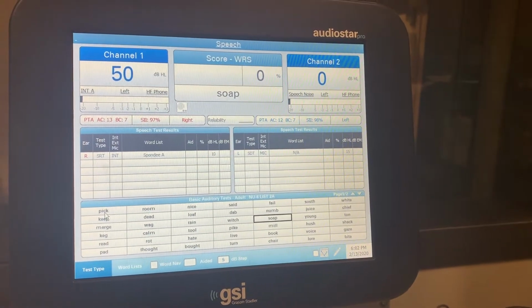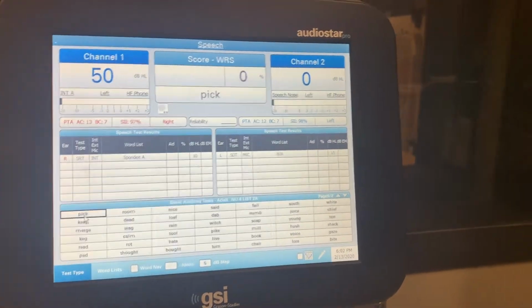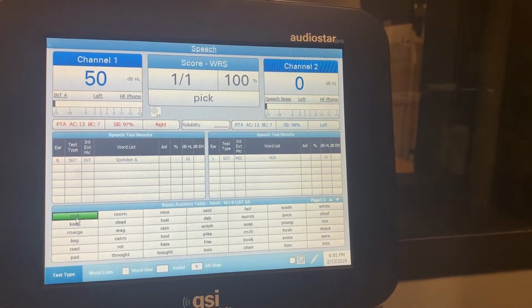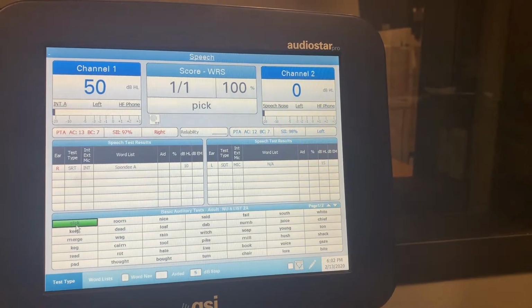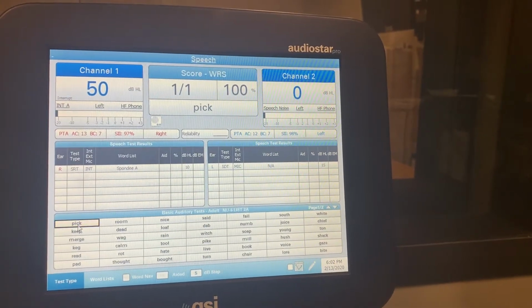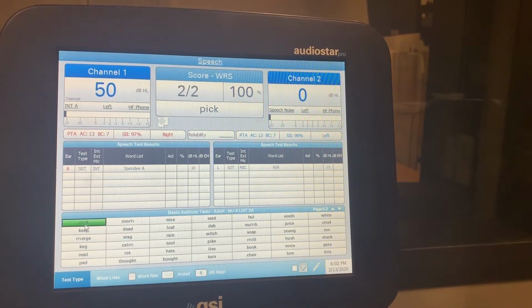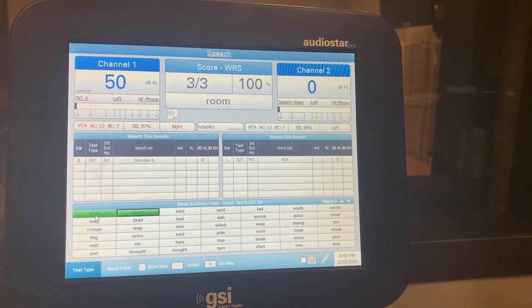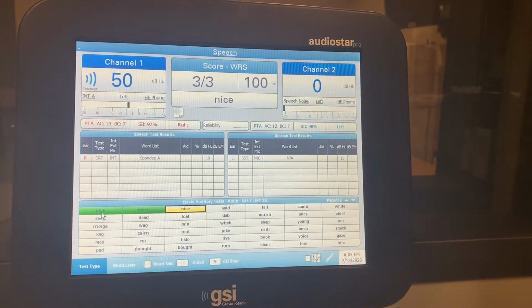All right, so we're going to start this over and show you what to do in case you mess up. So you can start here. Let's say you hit correct, and for whatever reason, it didn't move forward to the next word, and you hit interrupt, and it's like, oops, I already said that one. But if I mark it again correct, you see my number gets higher.